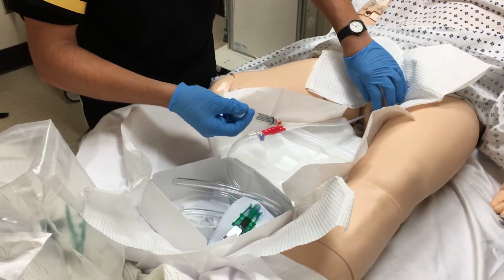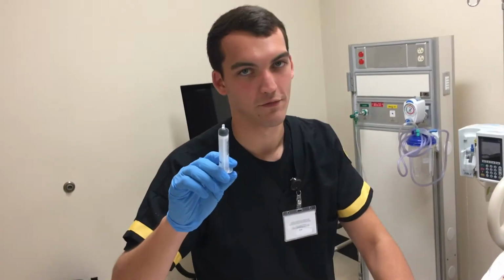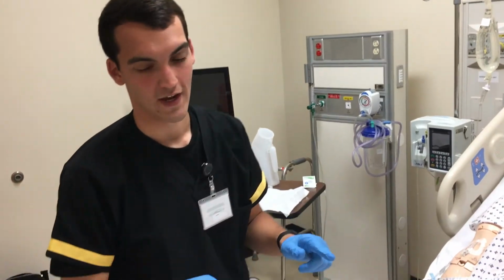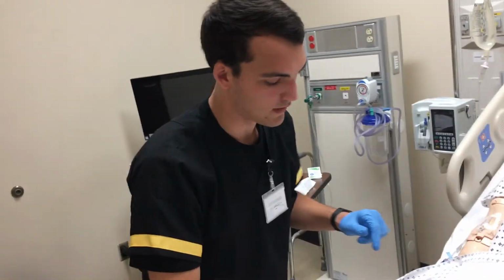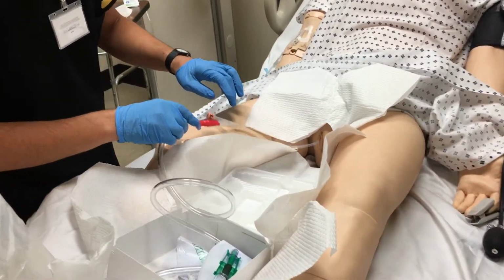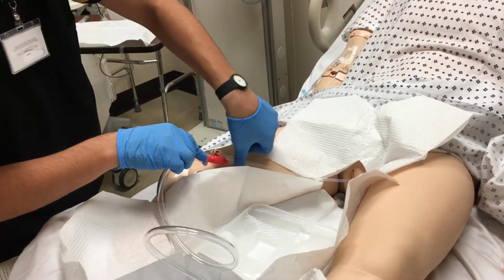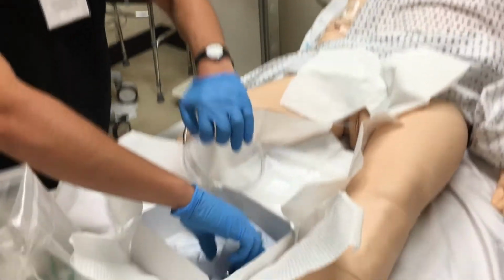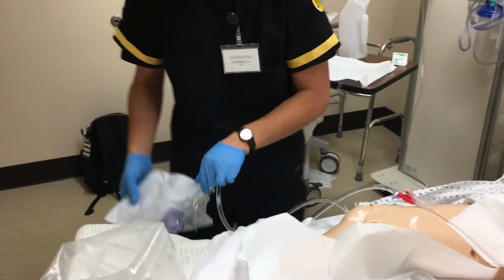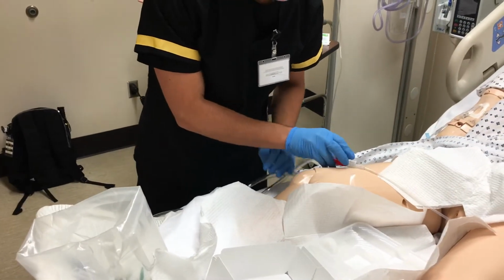Okay, now I'll go ahead and remove this. And I would normally throw this away, but for the sake of the video, I'm going to set it right here to deflate the balloon when we remove the catheter. And I'm going to go ahead and tape this to your leg. Make my dependent loop. Since this catheter is being kind of ornery, I'm going to tape it again.